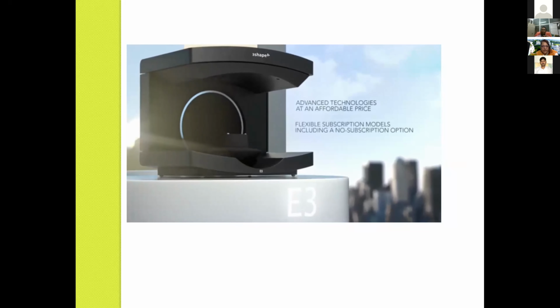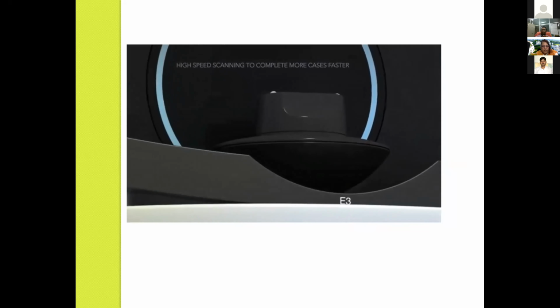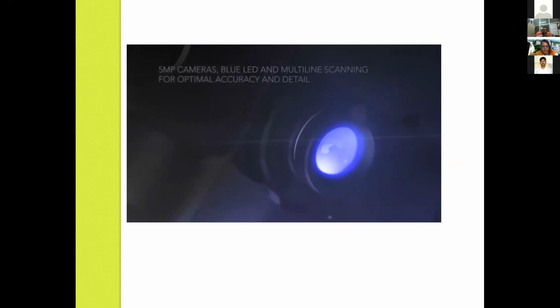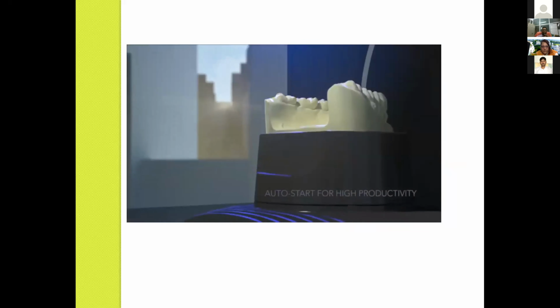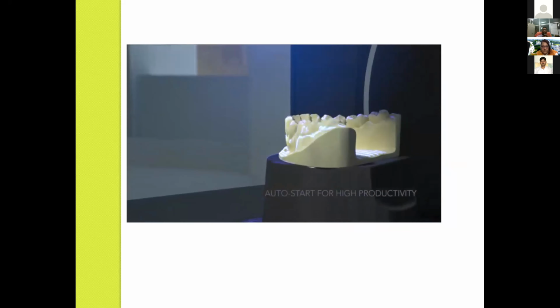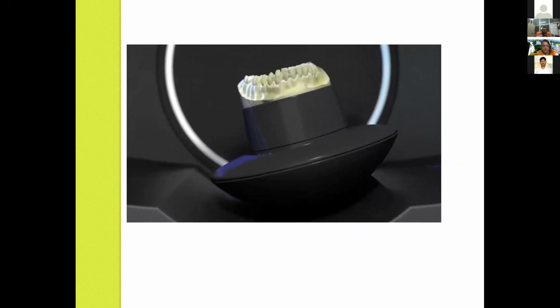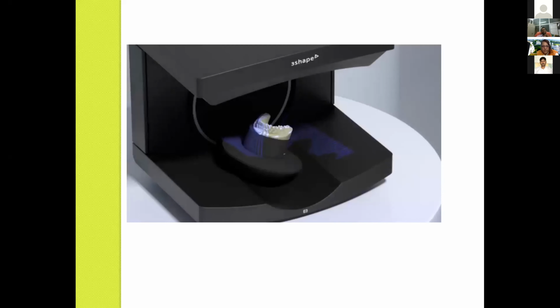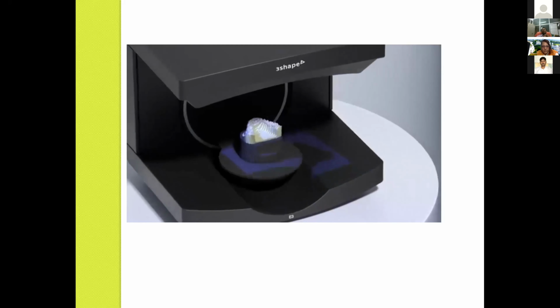Yeah, so this is the lab scanner we were talking about. After taking the impression, we put it here, and then from the top side the scanning lights or lasers come over it.